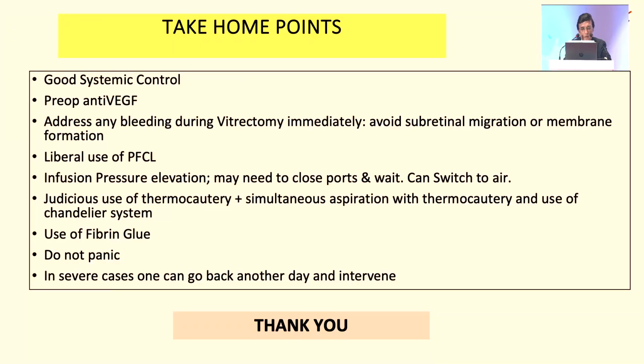And I have not used the fibrin glue, but yes, that could be a wonderful tool in hand. Always do not panic, just sit back and see what you can do. In severe cases, one can always go back on another day and intervene. We have done it in the past, though it becomes difficult because membranes form. And thank you very much, and thank you, Bhuvan, for this opportunity.